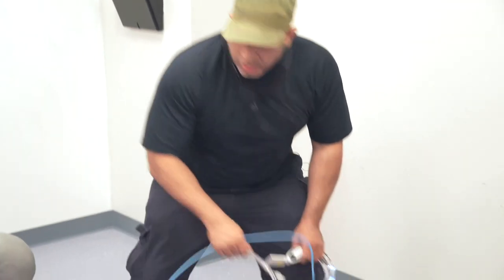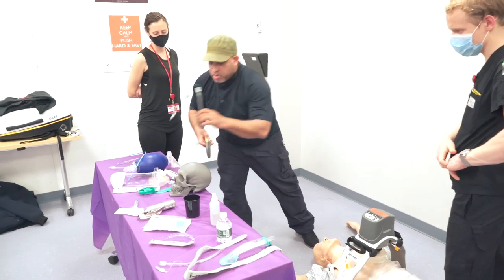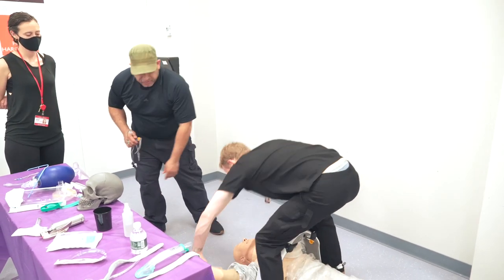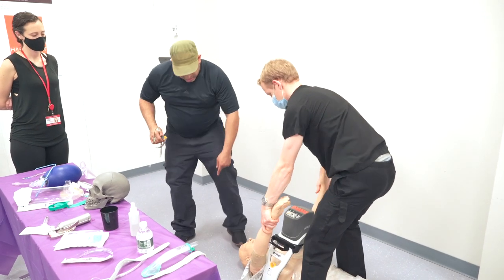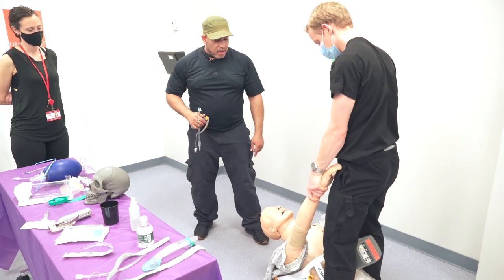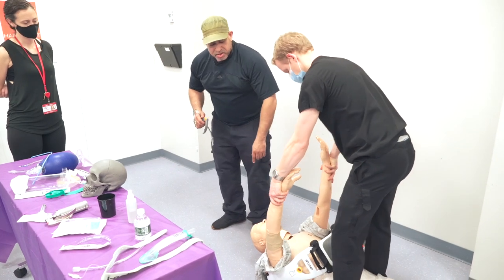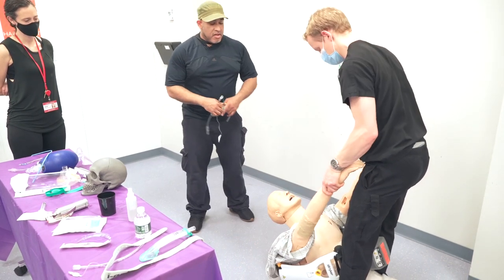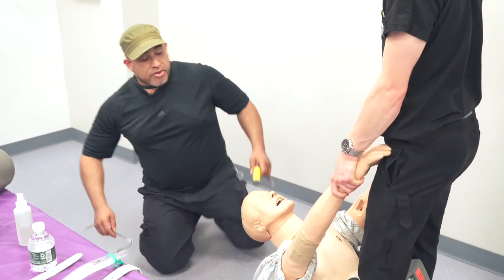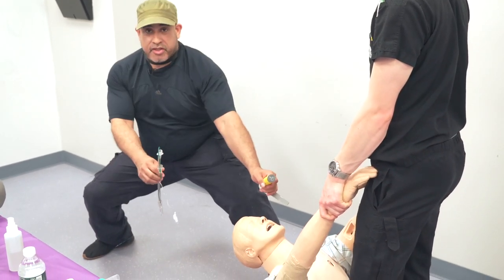That technique requires me to ask a colleague of mine to hold the wrist of the patient, and secure your ankles against the torso. Secure, yes. First, lower down a little bit. Secure your ankles first against the torso, like the hips, so it doesn't move. And then lift. So now I don't have to be on the ground as much. I can get on both knees. If I really want to practice my yoga or my Bruce Lee stance, I can intubate like this, or I can just do this.